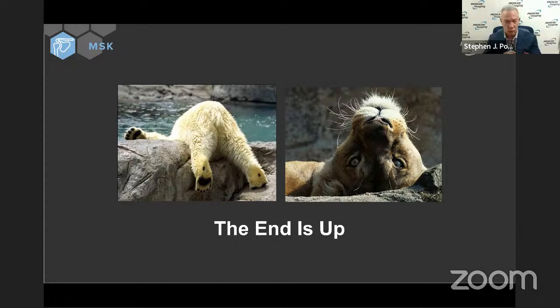Now for my standard elbow, I like to have at least one PD fat sat and at least one T1 and at least one T2. Now, where am I going to put these? It depends on the diagnosis.